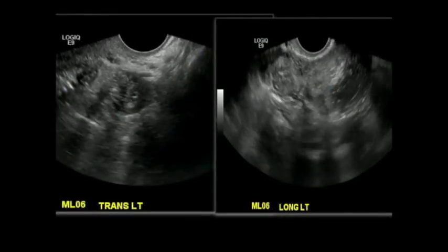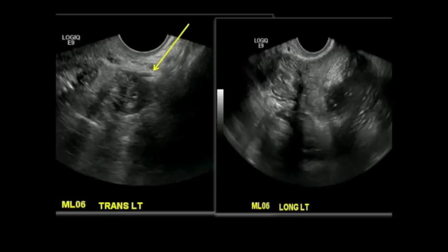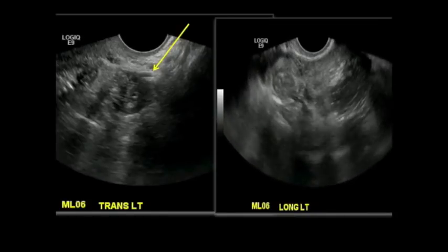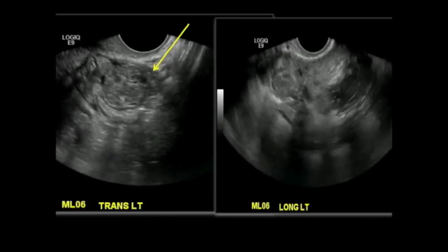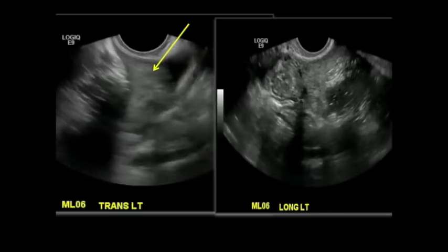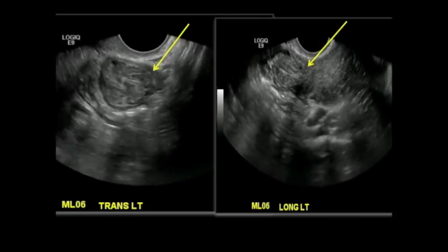So this is an example when there was a dermoid, and you could see that the twisted vascular pedicle kind of looks like mass-like next to the ovary. See, the other cine is not playing. Here it is. You can see the twist, and next to it was the ovary with a dermoid. So really look for those. This is very helpful in those cases.